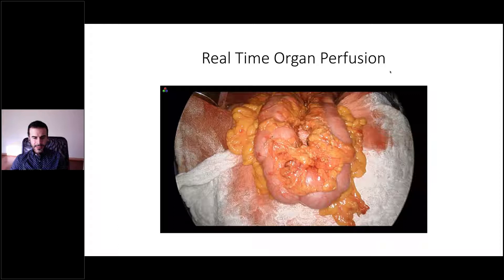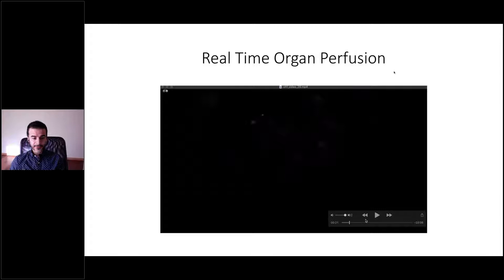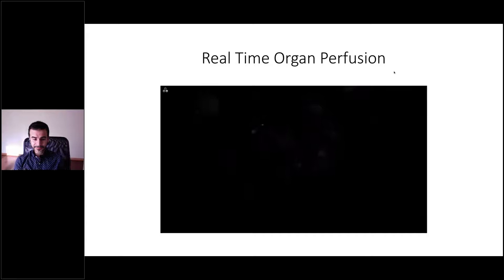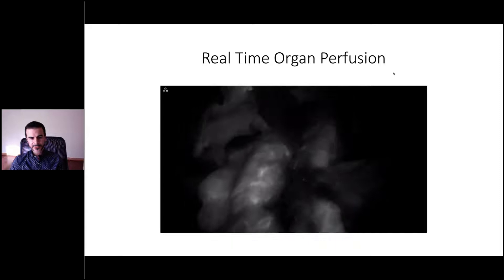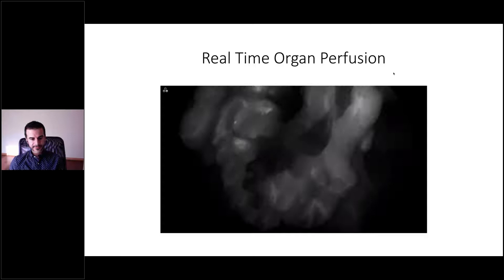This example is a patient with advanced gastric cancer post neoadjuvant chemotherapy. To achieve an R0 resection, I had to perform a distal splenopancreatectomy and resect a large part of the mesocolon by direct infiltration. The question was whether I also had to resect the transverse colon — and the answer was given to me by the fluorescence. In infrared vision the transverse colon was well perfused. Without fluorescence I would have resected it, but fortunately it was not necessary.